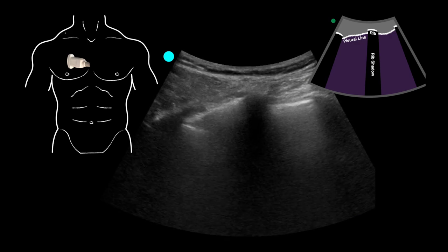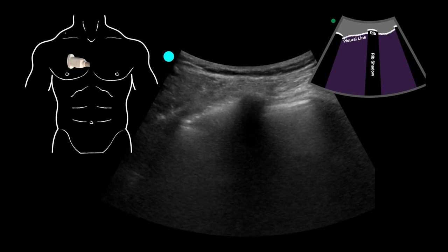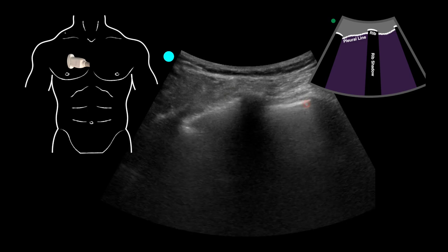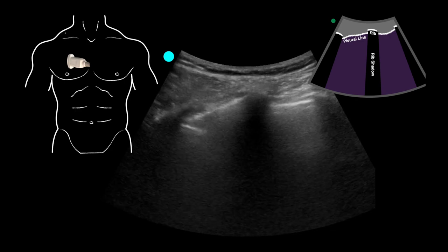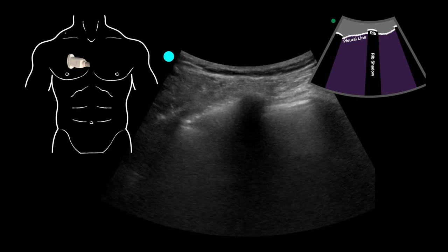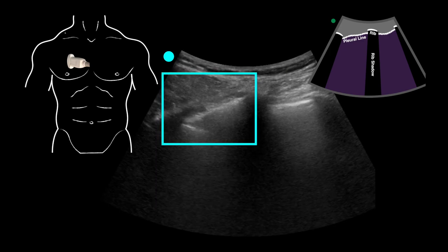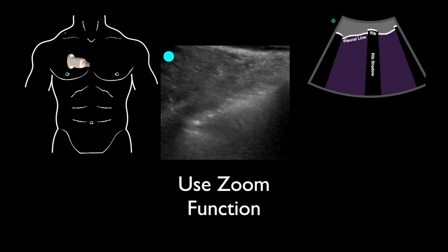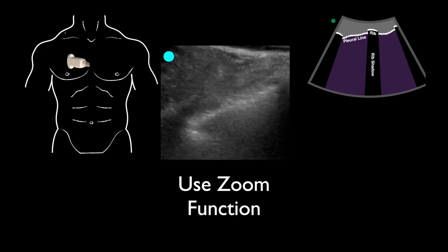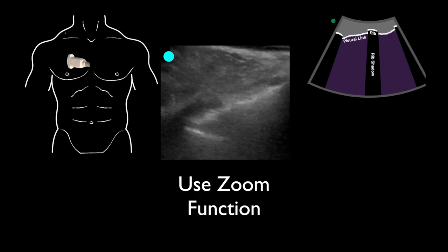We need to recognize the ribs and evaluate along the pleural line for lung sliding. Along this pleural line we watch for it to shimmer back and forth. Some people describe it as looking like ants marching, others say it looks like shimmering or sparkling. Whatever it looks like to you, it's important to recognize it. Make sure your hand is nice and stable, otherwise you won't be able to tell if movement is present. You can use the zoom function to zoom in and see that flicker of lung sliding along the pleural line.